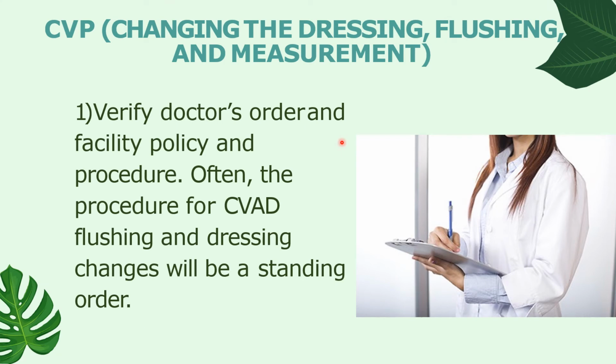So now let us proceed to the procedure in your CVP, changing the dressing, flushing, and measurement. First, it is important to verify the doctor's order and the facility policy and procedure regarding central venous pressure monitoring, changing of dressing, and flushing policy. Often, the procedure for CVAD flushing and dressing changes will be a standing order.